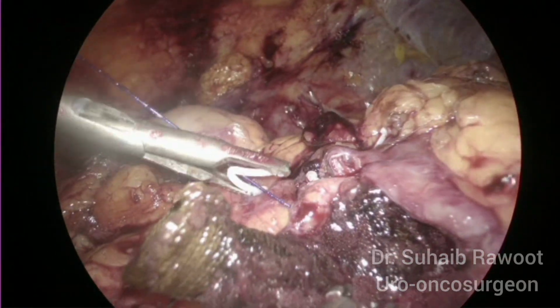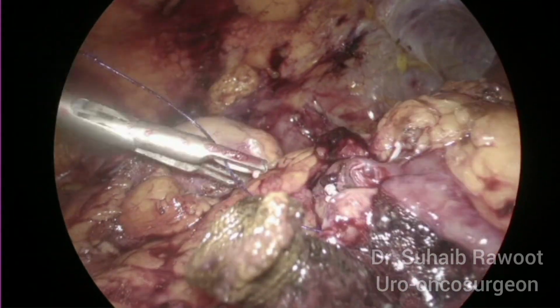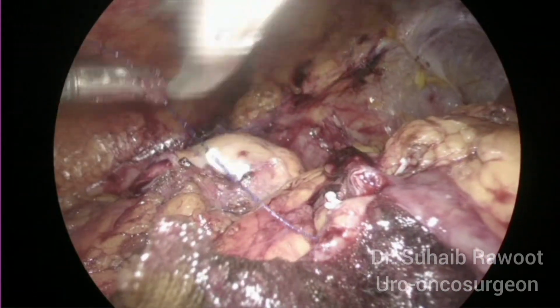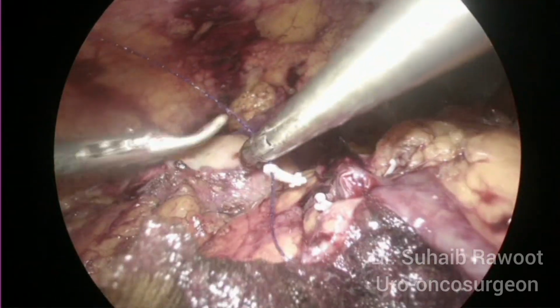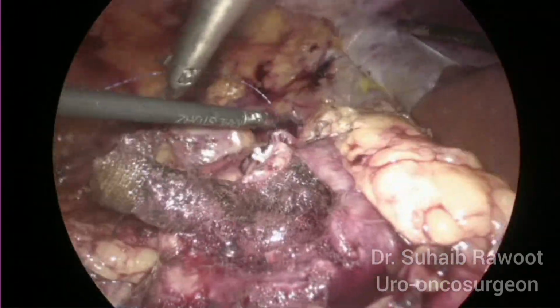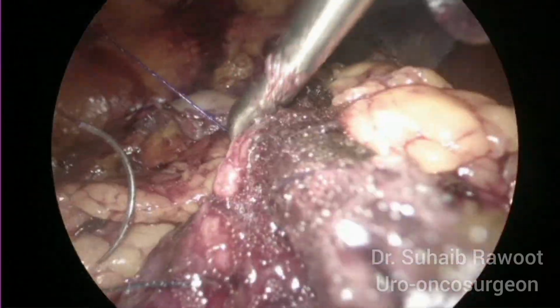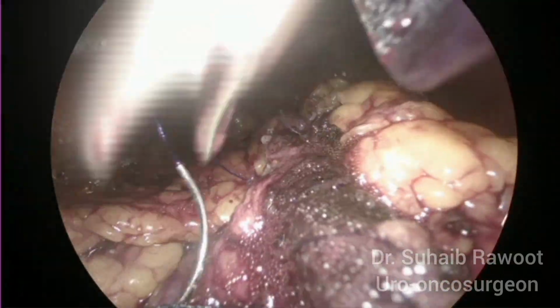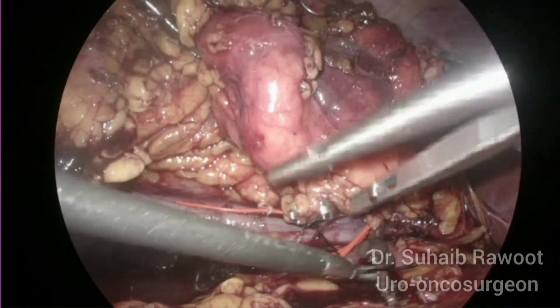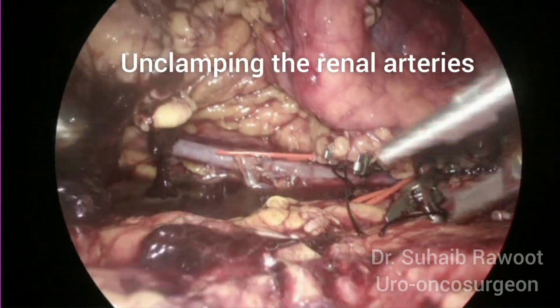You can use either a 5 mm or a 10 mm Hem-o-lok to apply on the suture. Here we are using a 5 mm Hem-o-lok. Outer renorrhaphy is now completed and now we are removing the arterial clamps.